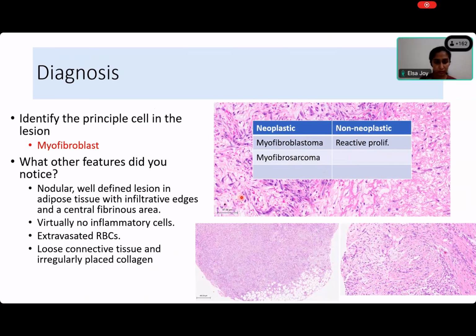The morphology of the lesion. It consists of stellate cells as well as spindle cells. Yes. And there was extravasated RBCs, and the lesion was also infiltrating the adjacent fat. So why isn't it a sarcoma or a myofibroblastoma or something of that sort? What tells you that this is a benign lesion which you call nodular fasciitis? And there was no atypia and increased mitosis. There was no atypia. My God. Really? Ma'am, and no mitosis. I just showed you mitoses in this lesion. There were mitoses. So what did you use?